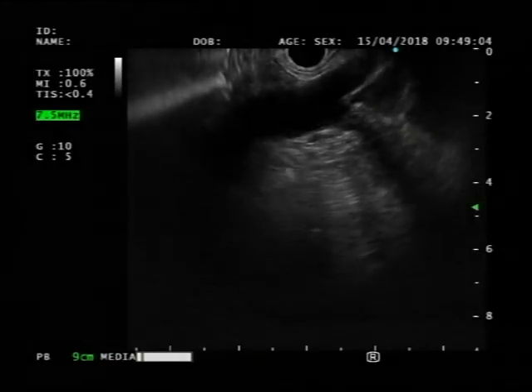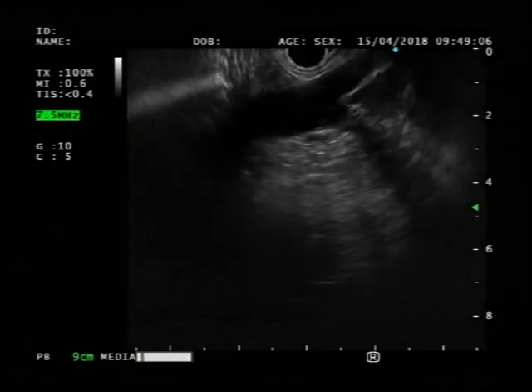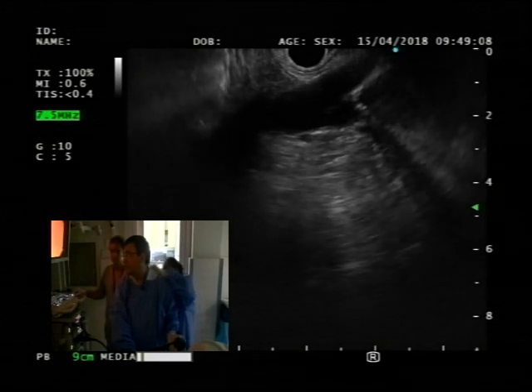We need the EUS views, please. Oh, can we put that EUS view now? Do you have it? Yeah, we got it now.